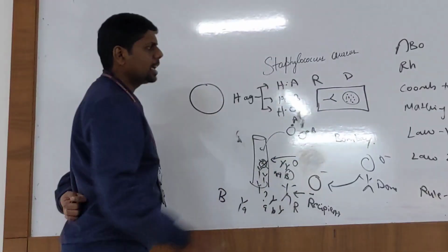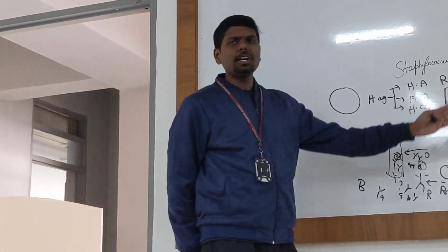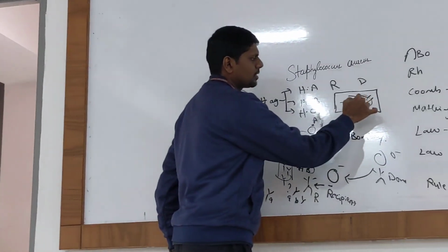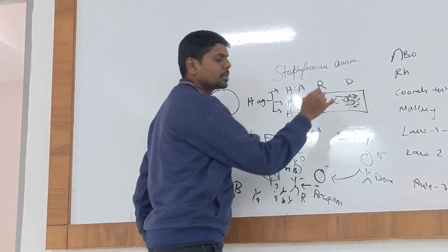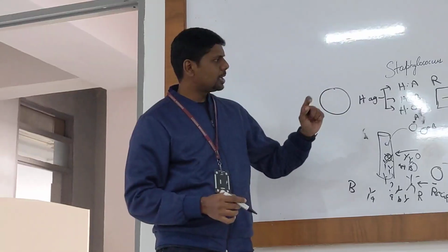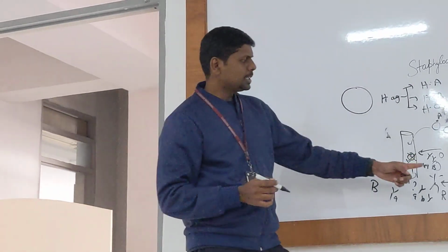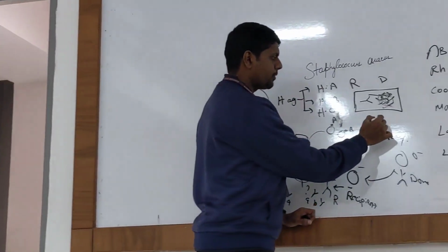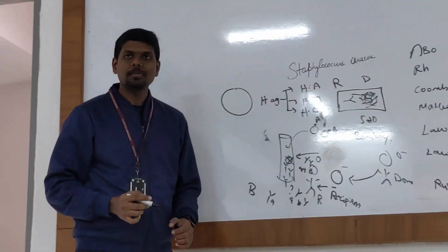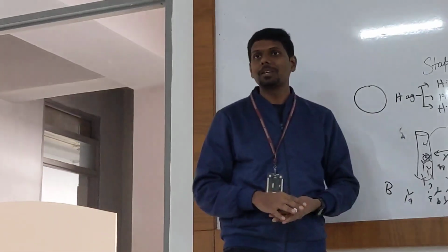Ideally, these antibodies cannot attack O group. Recipient antibodies cannot attack O group individuals, O cells. But interestingly, they are attacking. What's going on? So the scientists became very curious. What's happening in this patient? In India, we have only 5 to 10 patients like this. It's one of the rarest groups, where O group individuals have developed something that is attacking them.